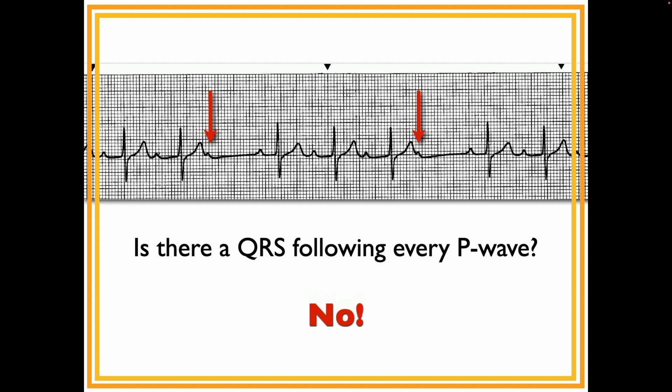Yeah, go ahead. So you said the U wave follows a T. So how would that look different? Oh, that's a very good question. There's two answers, one of which will make sense now and one of which will make sense later. Typically, if there's a U wave, it'll follow every T. I can't say never, but it would certainly be very rare just to have one little U wave pop up in the middle. That's the answer that hopefully makes sense now.